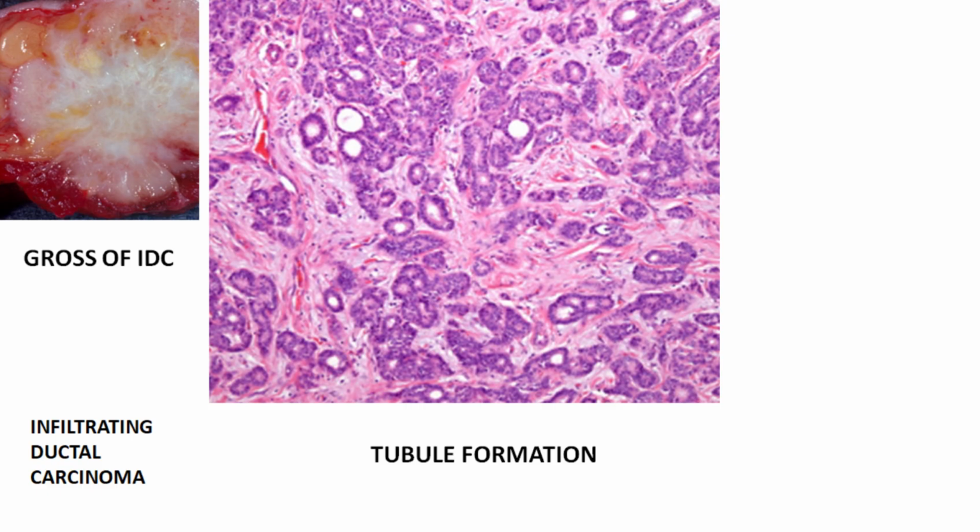And on microscopy, there is variable degree of epithelial hyperplasia in the glands. The ducts are present in a dense hyalinized stroma. The stroma is densely hyalinized and can show some stromal hyperplasia as well. Now, when it comes to carcinoma, I am not discussing a lot of entities. It will become too complicated then. I hope you remember the clinical features of carcinoma.